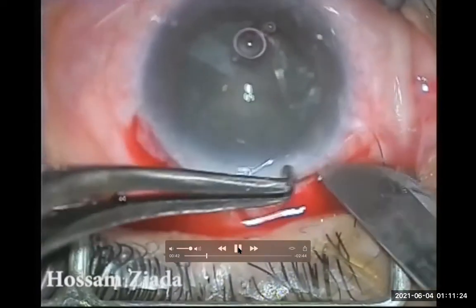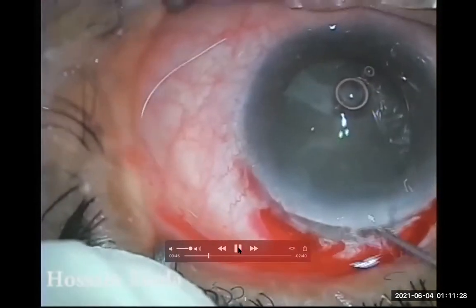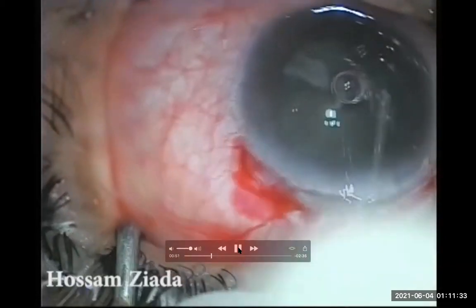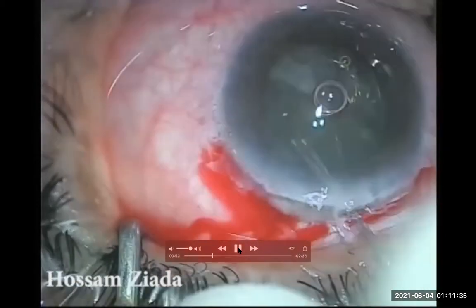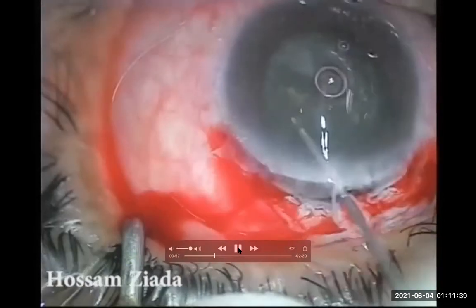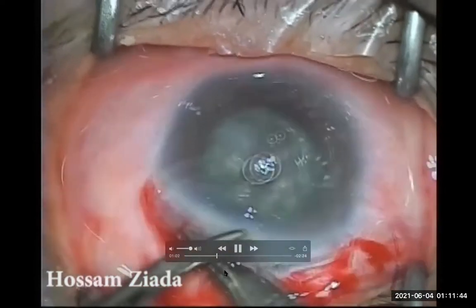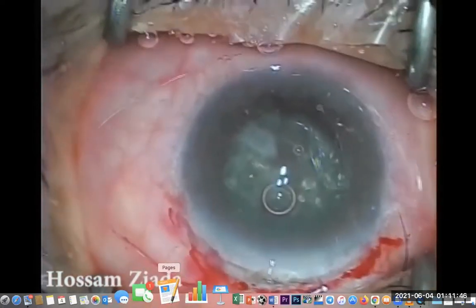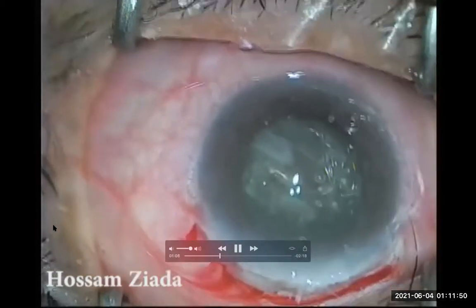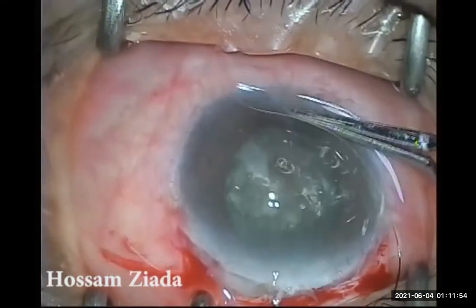So you will have two co-aptive flaps — not too long, not too short — to keep the sealing property for this wound. So I'm doing now the capsulotomy. Yes, it's classic surgery. Now I'm completing the opening of the incision with the scissors.